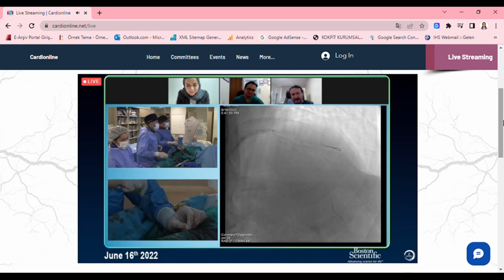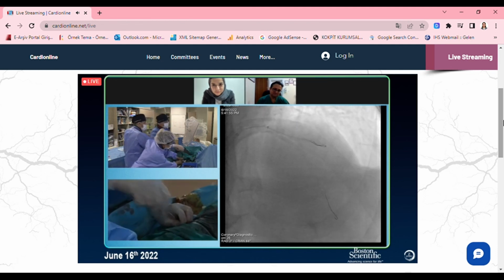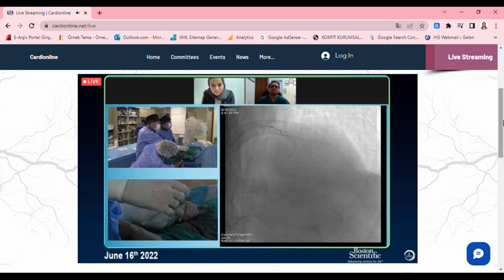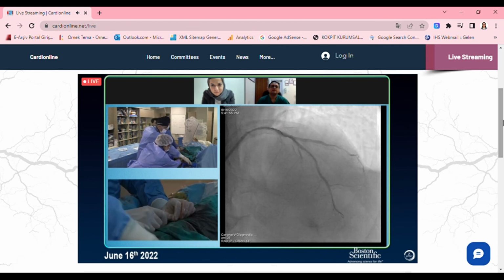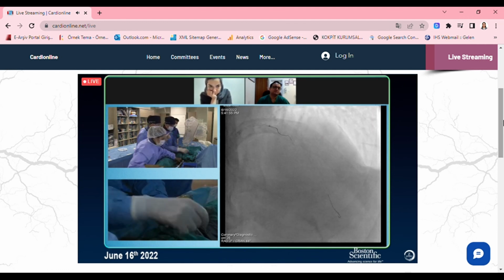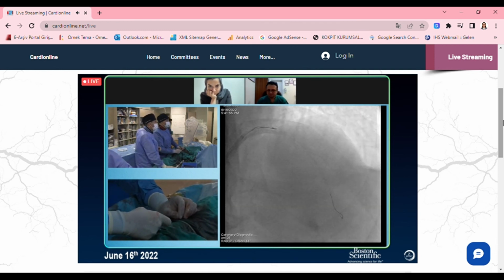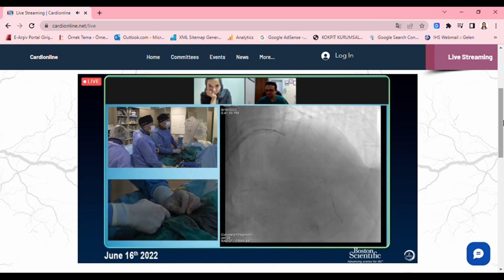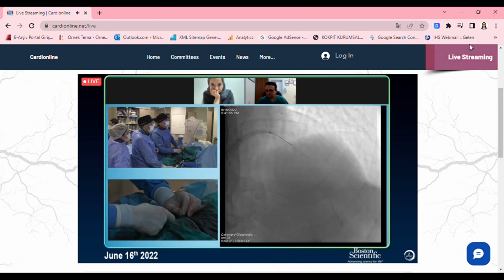All right, so what I want to do, I'll remove this diagonal and I'd like to recross it with this wire. So I hope I can do it, inshallah, and then I'll have a nice way to go down. Torque please. Torque. This side better. Alright. I like to use a balloon here for sport. I think this wire is kinked and needs a balloon.